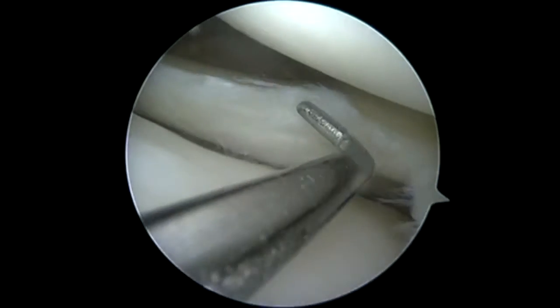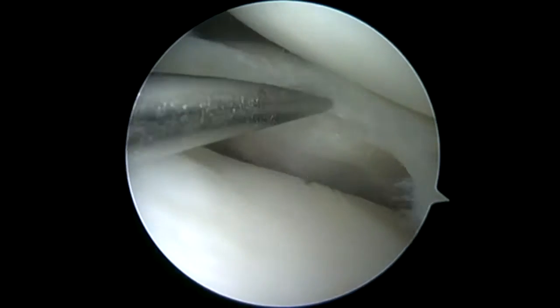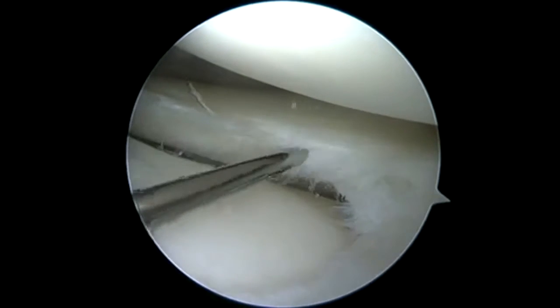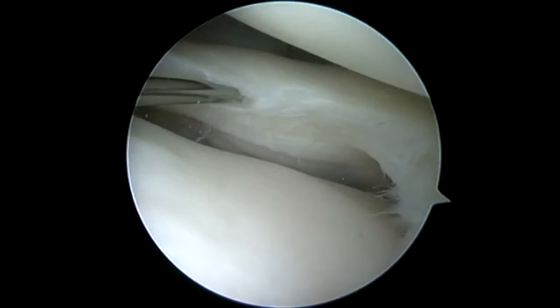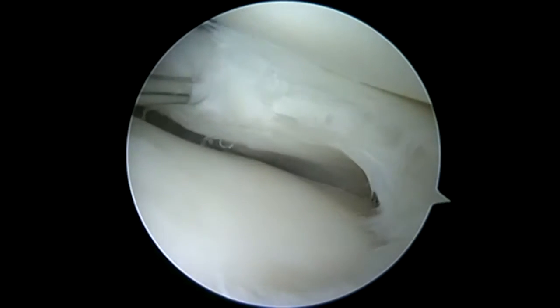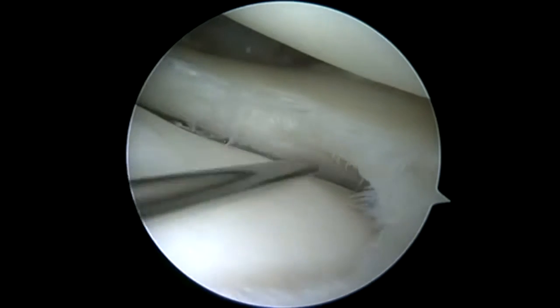This patient has had two prior arthroscopies. One was for repair. The second one was a diagnostic by a secondary surgeon who recognized there was significantly abnormal morphology. Happily, he halted on the case and referred her over for a secondary repair.